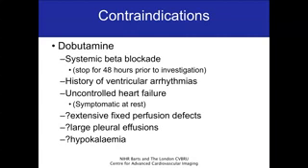Similarly, dobutamine, again, it's not a contraindication, but if patients are on a beta blockade, then dobutamine might not have the effects that you like, so you may want to stop the beta blockade 48 hours prior to the investigation. Alternatively, your approach might be, well, I want to see, is there any evidence of ischemia with the patient being on beta blockers?